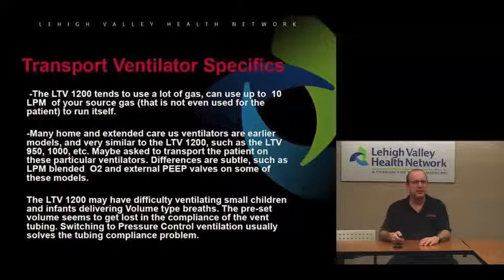Some specifics about the ventilators themselves that aren't really in the manual. You don't always realize the impact of this. The LTV 1200 tends to use a lot of gas, and it can use up to 10 liters per minute of your source gas just to run itself. So this is 10 liters a minute that's not even going to the patient.